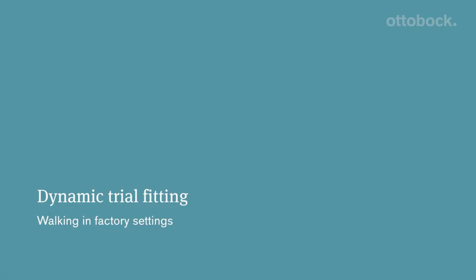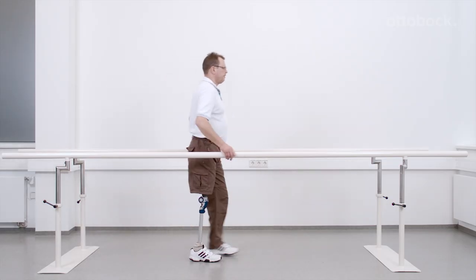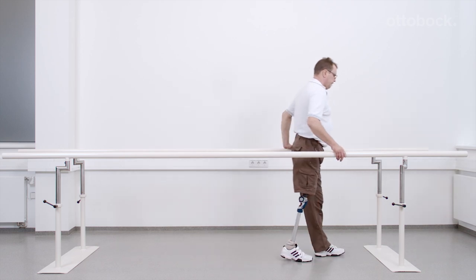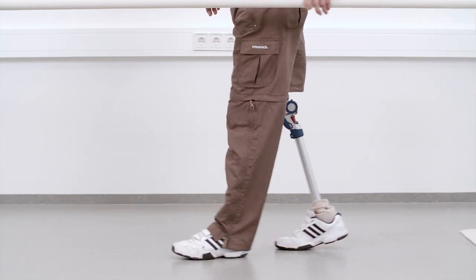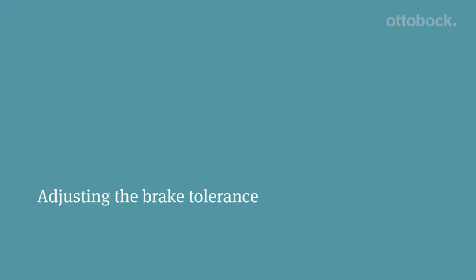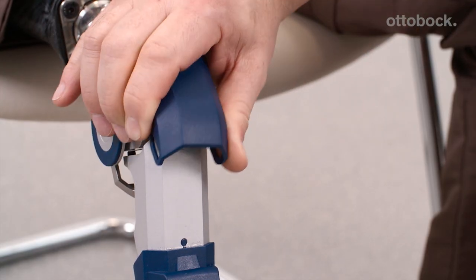To get a first impression of the knee joint swing phase control, let the patient walk in the parallel bars with the factory setting. The brake tolerance is already optimally adjusted as well. However, you may need to change the brake tolerance later on.